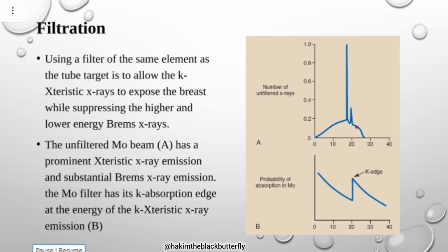Okay, so when vigorously compressed, tissue is brought closer to the image receptor and the focal spot blur is reduced. We have finished that. Compression also reduces absorption and scatter. Whenever the beam goes through a bigger object, the higher the probability that there will be a lot of interaction and scatter.